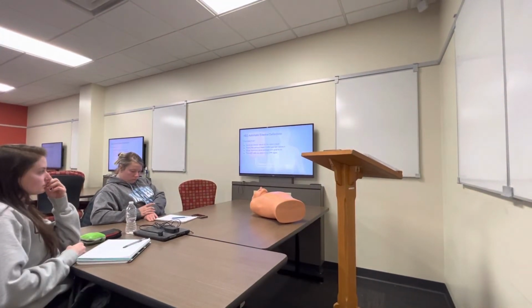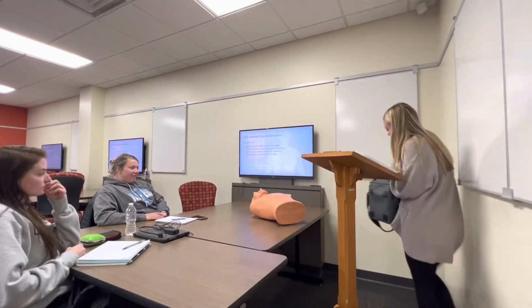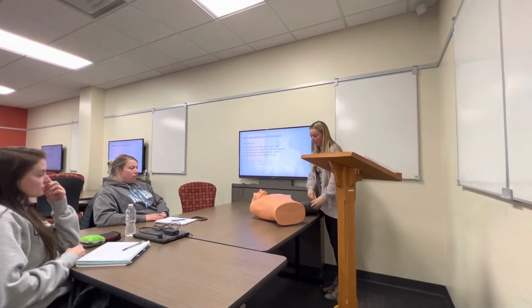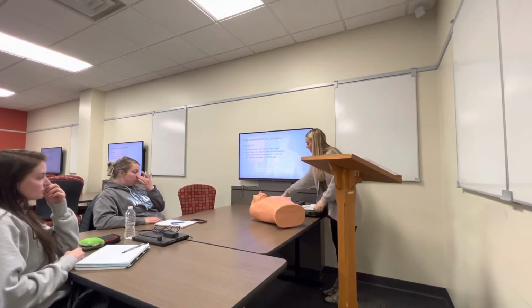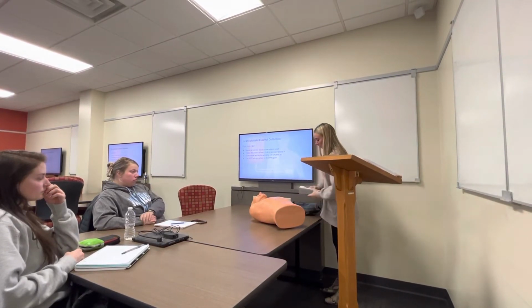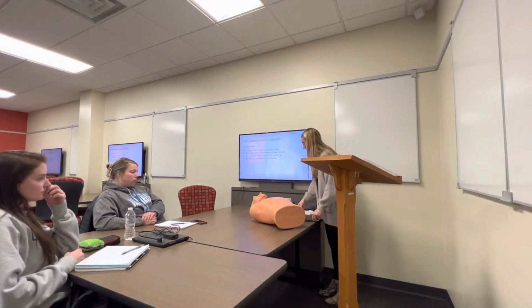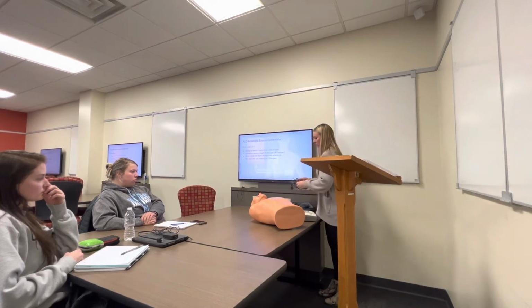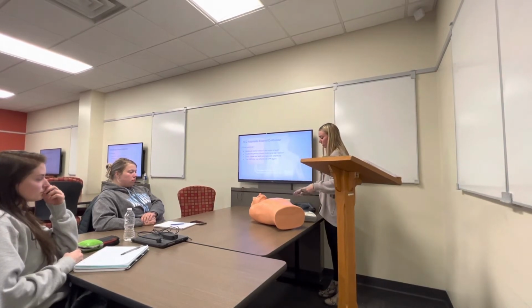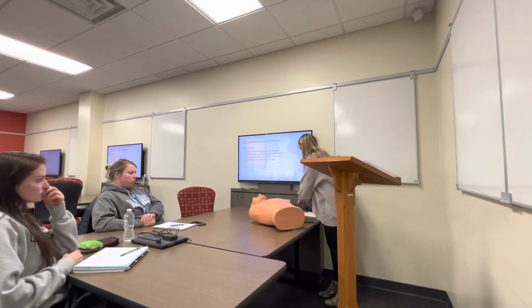with me. So usually, a lot of schools, businesses, other places have these available. If not, just continue with compressions until someone gets here. So it's just a little thing that looks like this. And then the pads are here. Sometimes they have smaller sizes for individuals like children, infants.